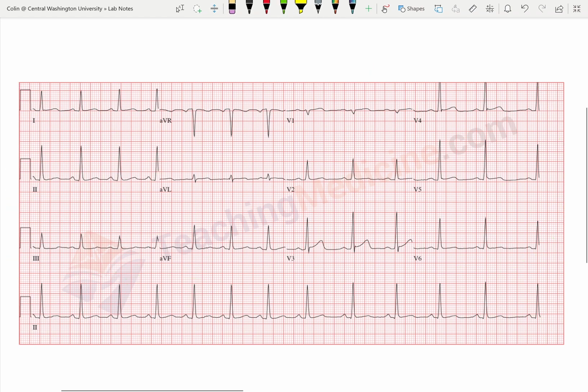So cool. With that, real quick, let's talk about the difference between 4 lead and 12 lead. A 4 lead is going to be with 4 stickers. If you're used to putting these on, they're called the limb leads. There are different spots they can go, but traditionally, if you go by the book, the left arm goes on the left wrist, right arm on the right wrist, and then your 2 leg leads will go on the inside part of the lower calf. And that's going to give us the views of 1, 2, 3, AVR, AVL, and AVF.